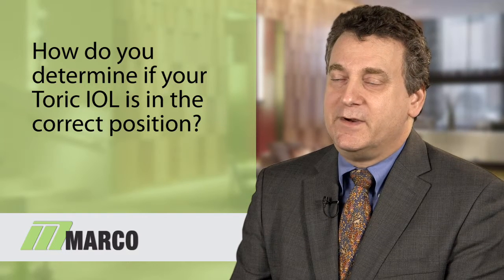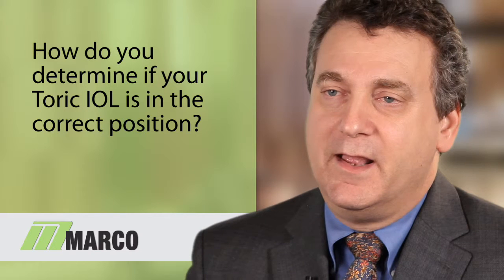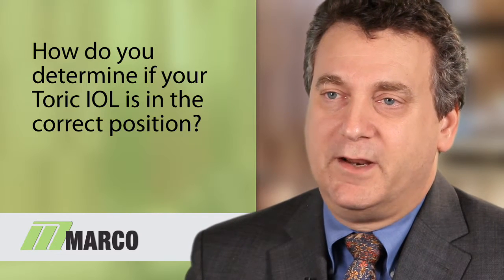But there will from time to time be patients, either in your own practice or that you see in consultation, where their expected outcome with the toric implant isn't as spot on as you want. One of the beautiful things about the OPD-3 scan is it allows you to take a retroillumination image that lets you see the toric marks and place on the eye a reticule so you can see the exact axis the toric lens is sitting at. That, along with a number of the diagnostic calculators that let you assess how to manage the patient, is really critical in solving these occasional toric missteps that you may see in getting the best clinical result for your patient.